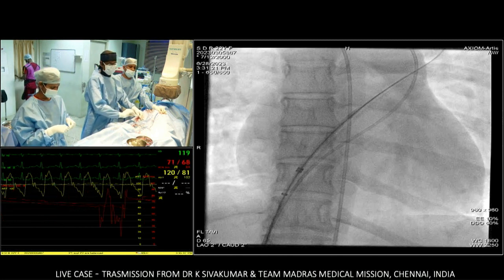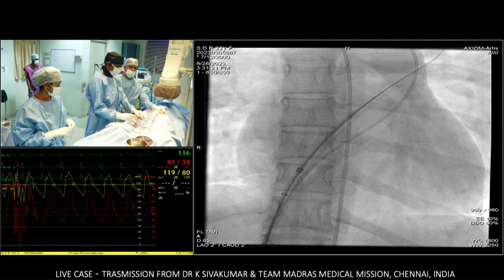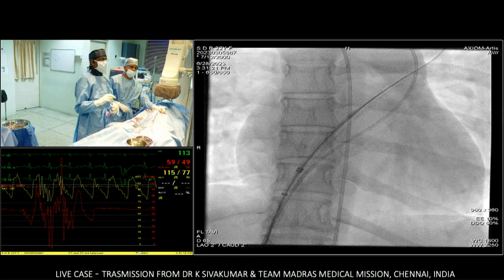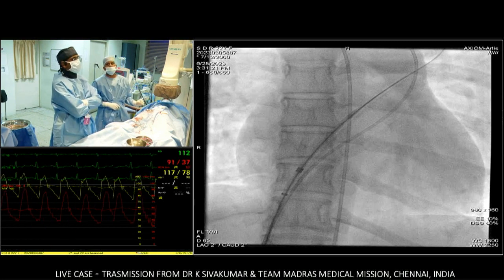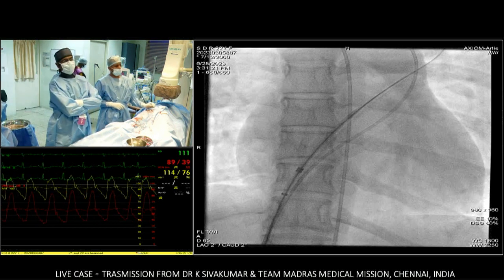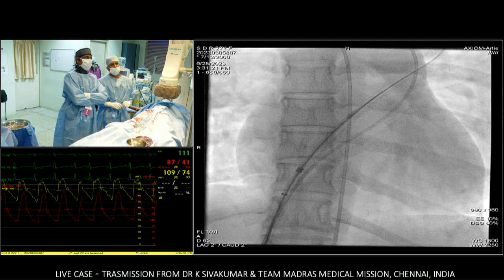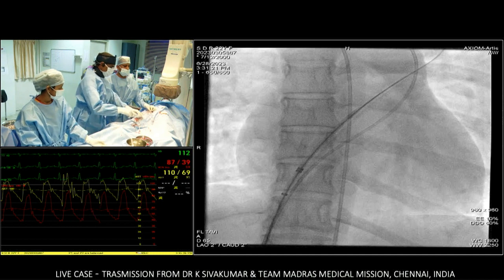I too had this sort of idea that in a post-tricuspid shunt, a closure of the shunt is going to result in an acute drop of the pulmonary artery pressure. But in a pre-tricuspid shunt, the drop will not be there. However, on the contrary, when we started balloon occluding many of our pre-tricuspid shunts, that includes sinus venosus defects as well as secundum atrial septal defects, we have observed time and again there will be a substantial drop of the pulmonary artery pressure immediately on balloon occlusion. Let me see what happens to this particular patient.